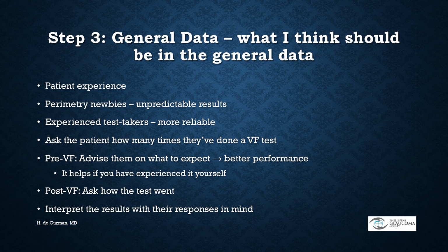responses in mind. For example, if the patient says, "Yeah, during that last perimetry, I was getting a little sleepy, my eyes were drying up." So you now will understand why maybe there's more artifacts this time, or why the results are not so reliable this time.